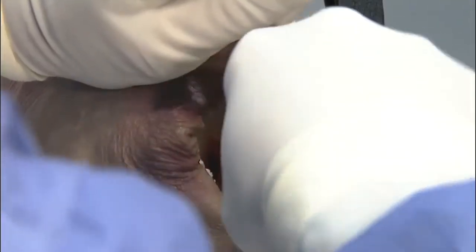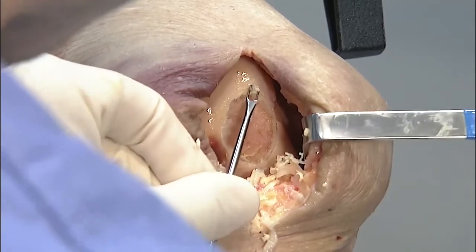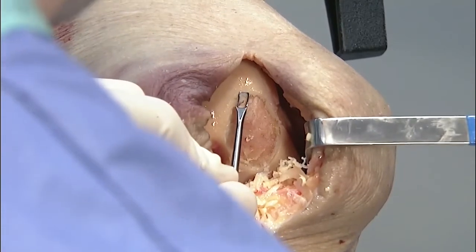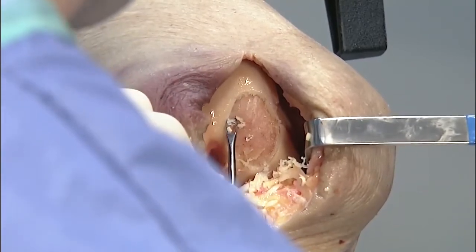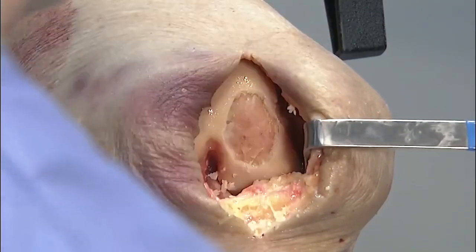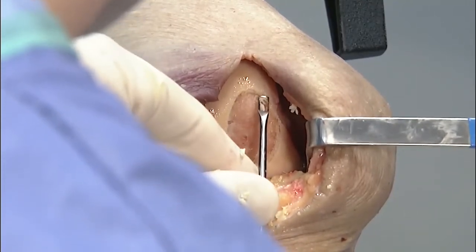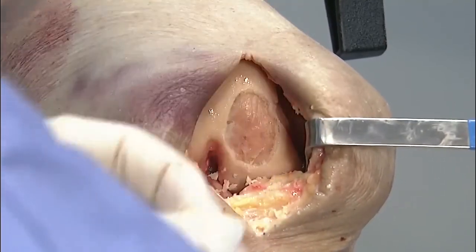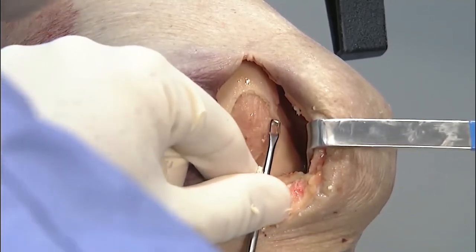I know that we're in a cadaver here, but let's say that you got into some bleeding bone. What's your method there? Do you let the tourniquet down, fibrin, or what do you do? Your knee's in flexion, so you get a tourniquet effect with the vessels anyway. One other tip that's really helped me is we've started using tranexamic acid on all the cartilage patients. It has tremendous safety data from our total joint colleagues. I started using it on osteotomies and saw a huge difference in less bleeding. Since then, I've been using it in the cartilage patients, and I've noticed perhaps that their subchondral bone bleeds a little bit less. So I think that's a big advantage.